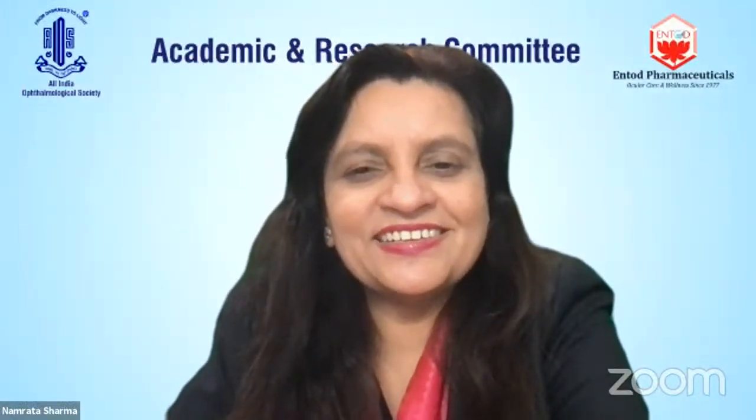The advantage with bimanual is with the irrigation, you can actually retract the iris and take out the cortex where you intend to. Yes. Absolutely. Coaxial also, you can do that with the Y rotator, no? I think just retract the iris. Y rotator, I don't know. Not all of us have a Y rotator. Oh no, it's a second instrument. It's on the other side.